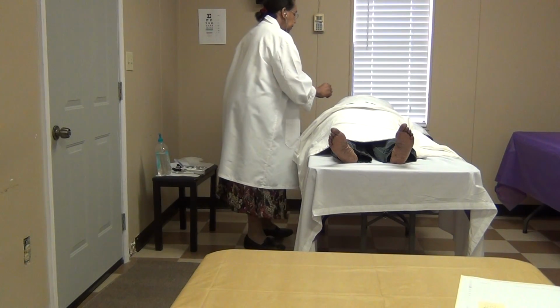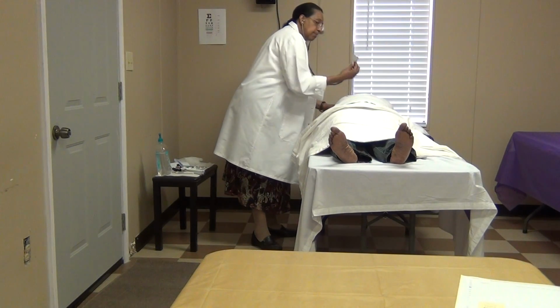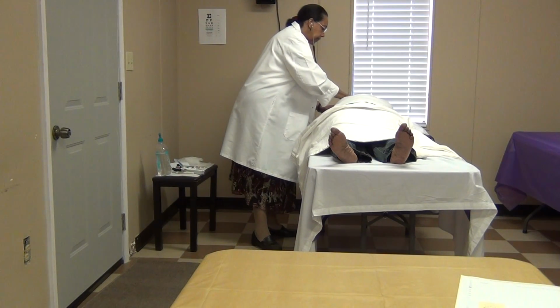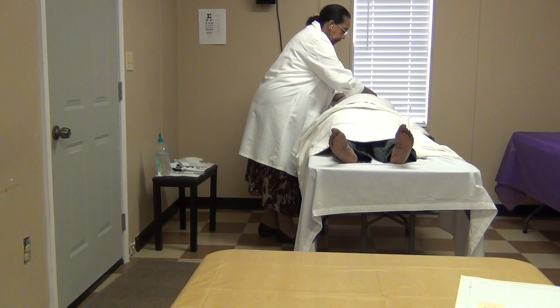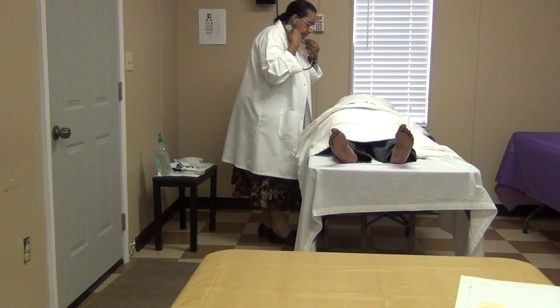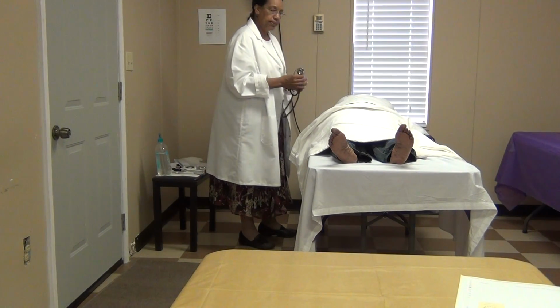And while my client is lying, I'm going to go on and check for her carotid bruit. I'm going to ask you to hold your breath for me as I move with the bell of my stethoscope down the carotid artery. Would you hold your breath? Breathe out. Again. Hold your breath. Breathe out. No carotid bruit noted. Okay.